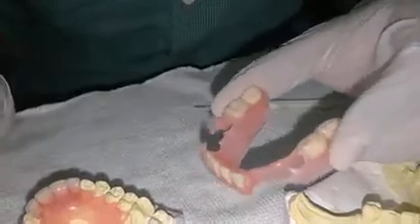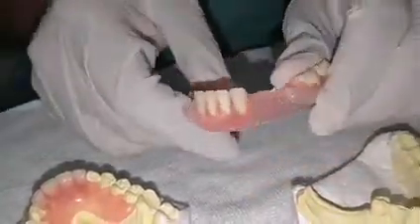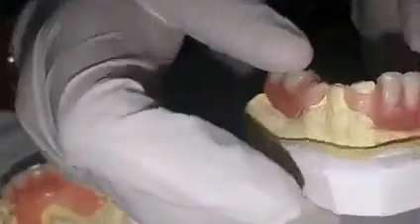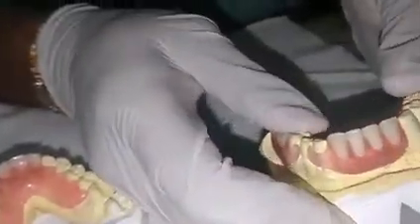The upper and lower are both flexible. These clasps are flexible, so they are very easy to wear — like this, you can see how easily it goes in.